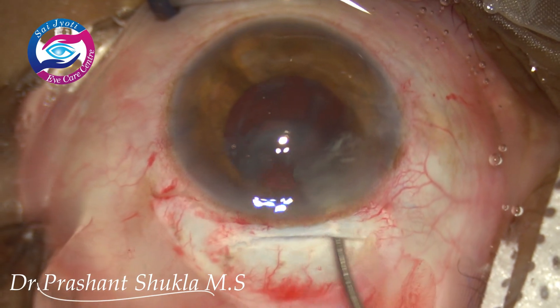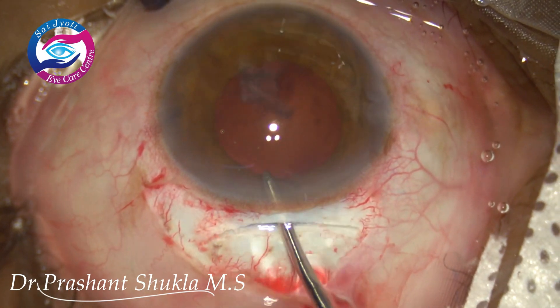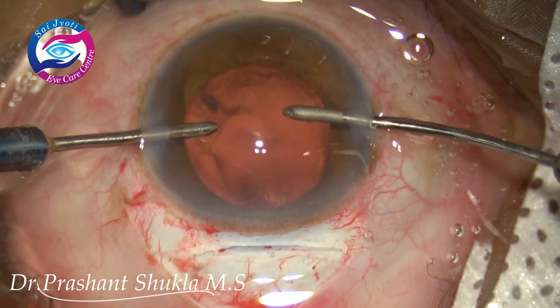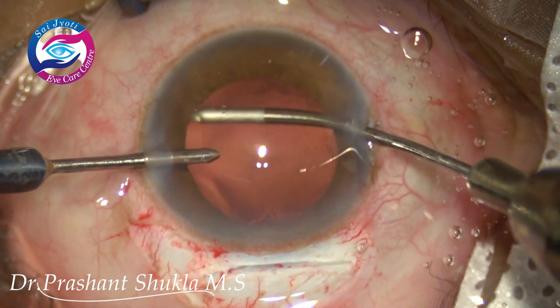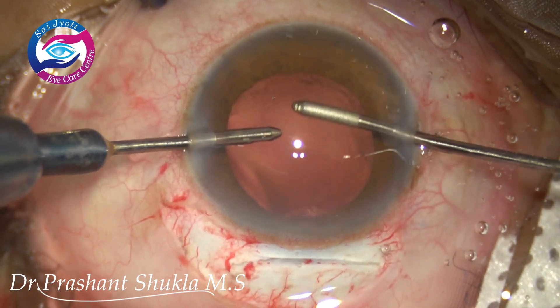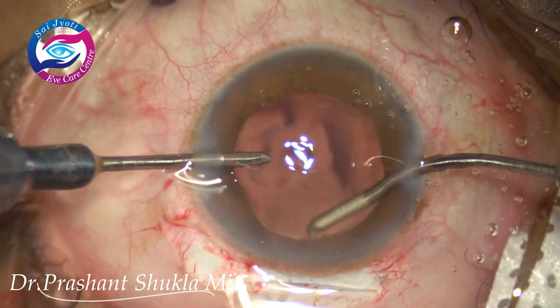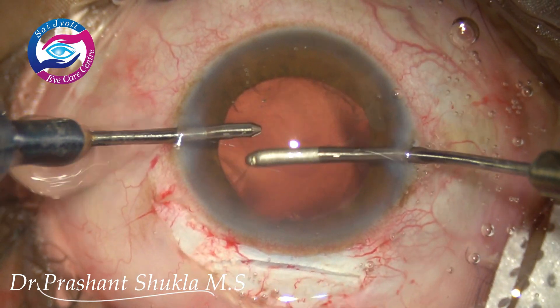Now is the time to remove the cortex. I am using the irrigation handpiece of the bimanual set to wash out all the cortex in the anterior chamber just by irrigating it. A Simcoe cannula can be used as well. Now using the aspiration handpiece, I am nudging out whatever cortex remains in the capsular bag. In this case I purposely avoided the Simcoe cannula because I thought the bimanual irrigation aspiration would be more convenient.